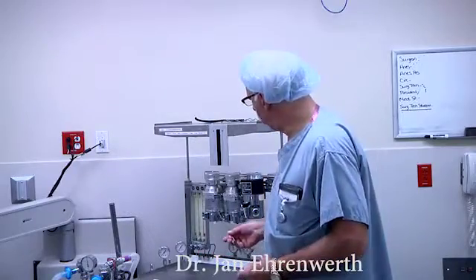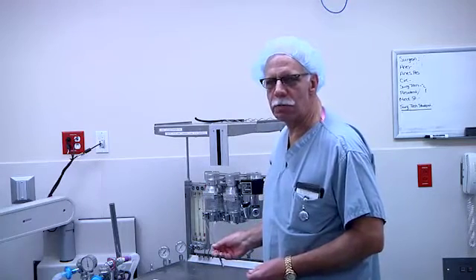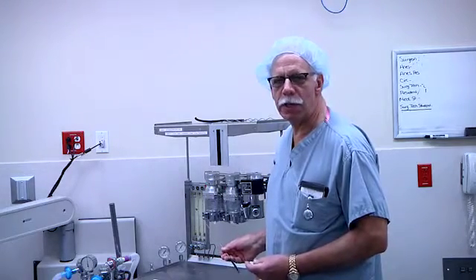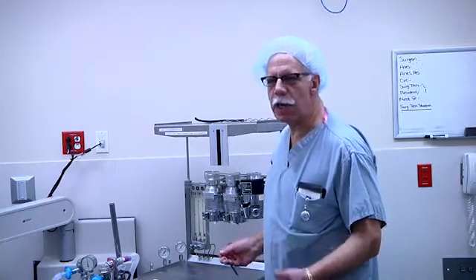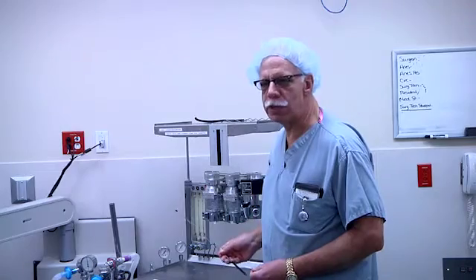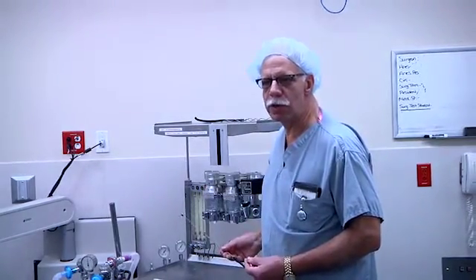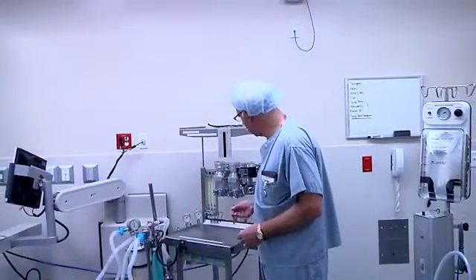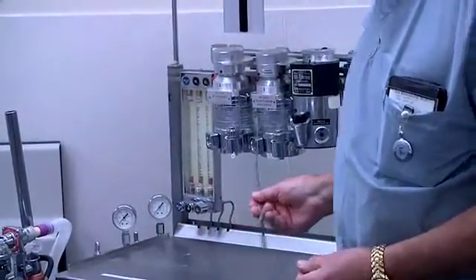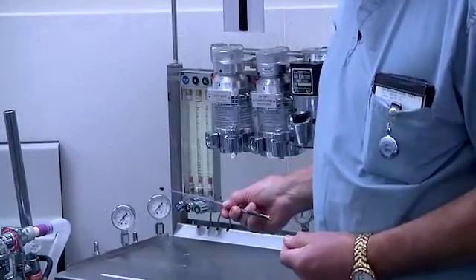This is the Boyle 50 anesthesia machine. It is a very basic anesthesia machine, but it was the prototype for anesthesia machines for the next 40 to 50 years — up until the time that the electronic machine came into being. Basically all of the functions of this machine were incorporated in a more sophisticated manner into machines that followed. We can see it's a basic three-gas machine with vaporizers, and it has very few of the modern safety features.